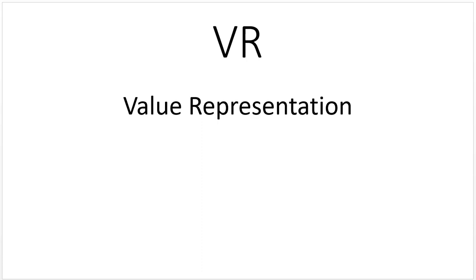VR stands for Value Representations. We will actually use VR in other ways in this program. We'll talk about voice recognition, and people will start saying VR this and VR that when they're talking about voice recognition systems, but in a DICOM class, VR stands for Value Representation. Don't get those two mixed up.